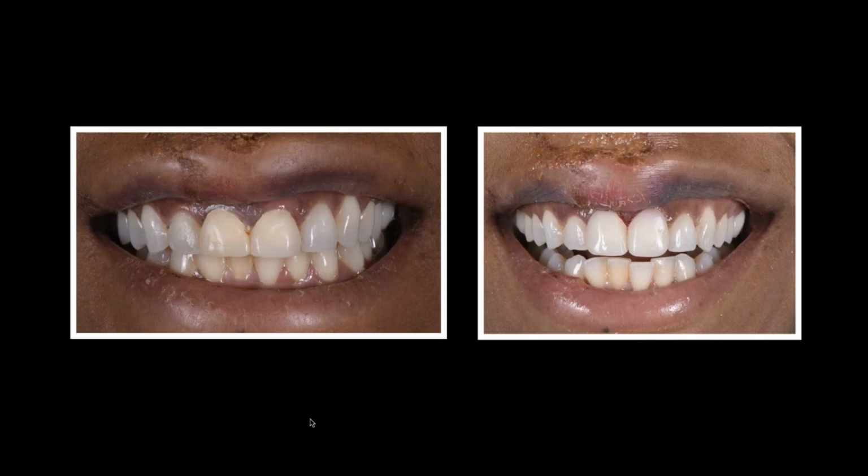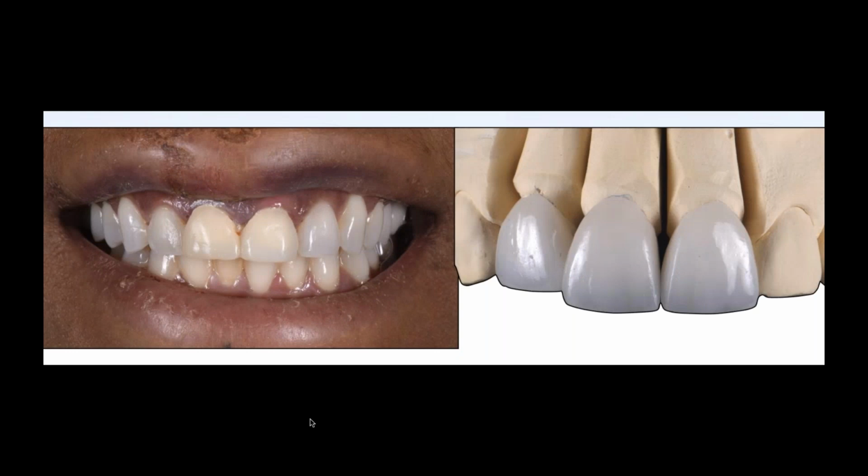Obviously, we visualized the patient. We did a little crown lengthening, tried to improve the scenario that she presented with, and finished the case with a 3-unit zirconia framework. It was actually 2 splinted units and a single unit. So I think the 2 centrals were splinted, if I remember correctly. It was done a while ago.